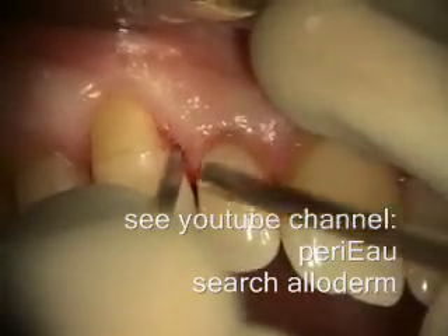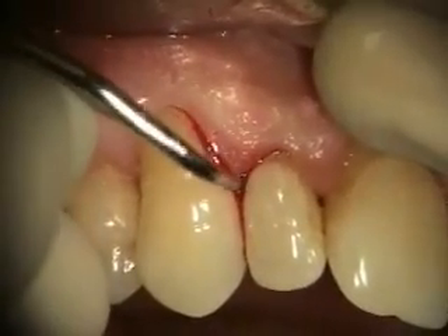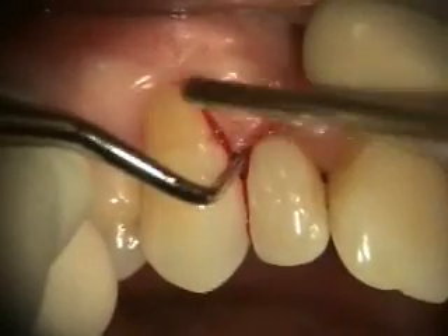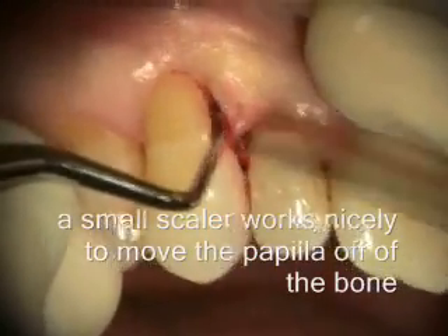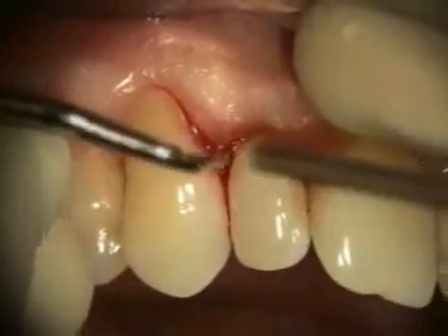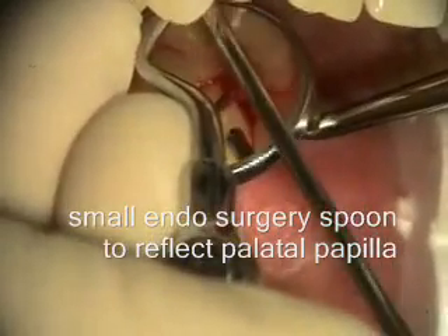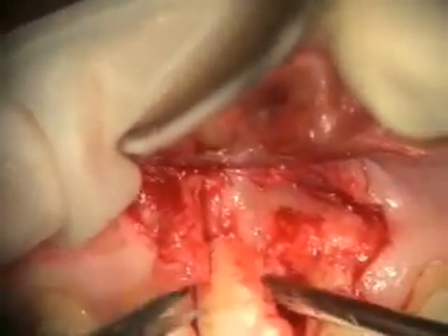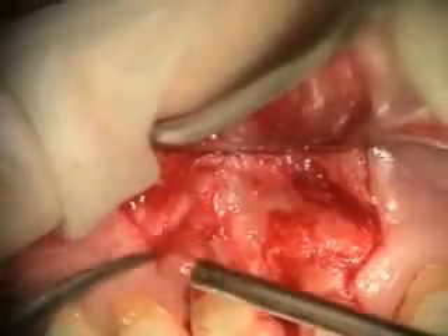I don't use these much anymore, but there's such a small site right here. It's a small site. So we've reflected our flap out a little more and now I'm dissecting the resorptive tissue.